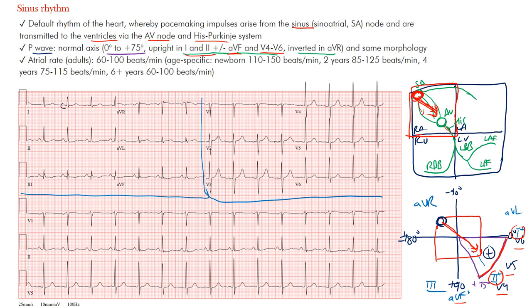Let's look at the P waves. In lead two they are more evident. You can see them in lead three — notice the direction. You can see them in AVF. The axis is probably closer to positive 75 degrees. On the left lateral leads, you can see some P waves — somewhat hard to make out, but they're there. And if you look at AVR, notice that AVR has negative P waves because the impulse is going away from this lead.